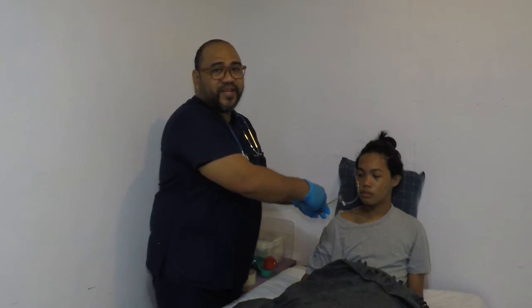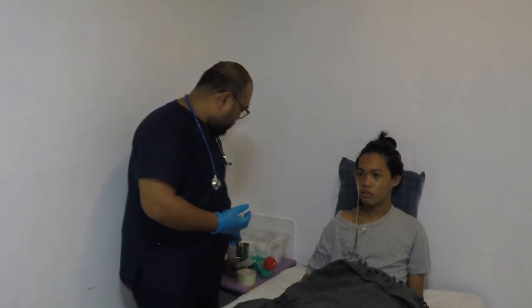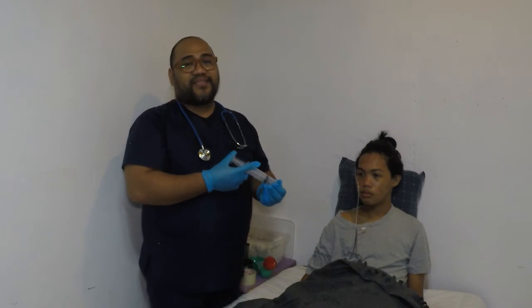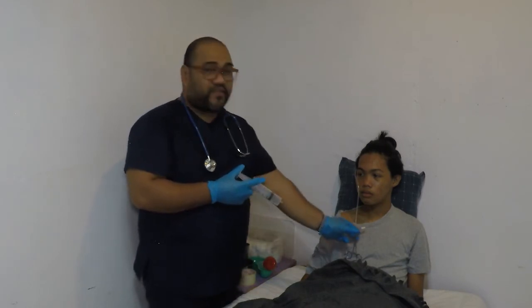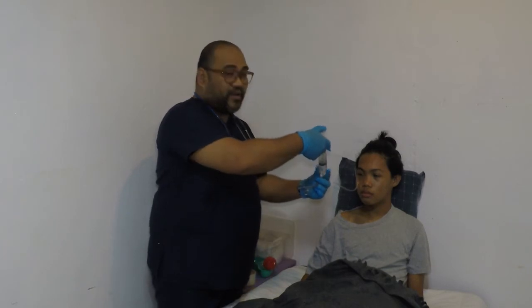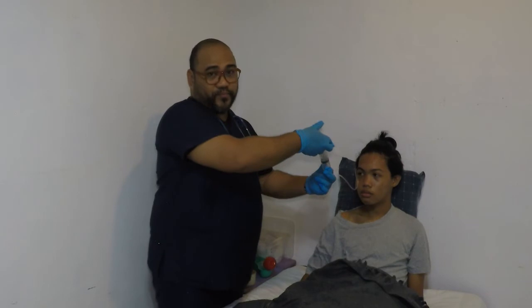So for termination of the feeding, we have to terminate the feeding when complete, then instill the prescribed amount of water. And keep the client's head elevated for 20 to 30 minutes. So every time, you have to clamp so that there will be no discharge. Then put water.